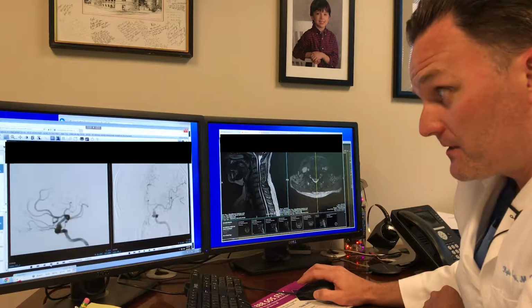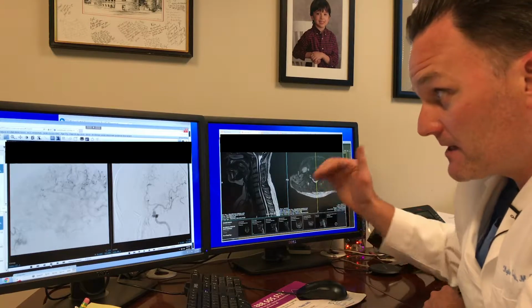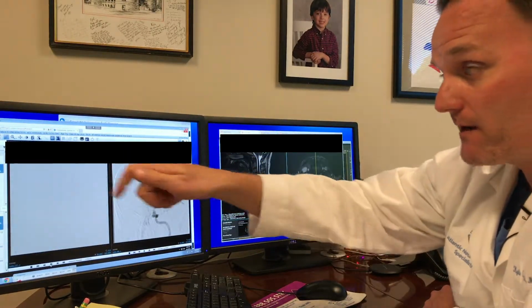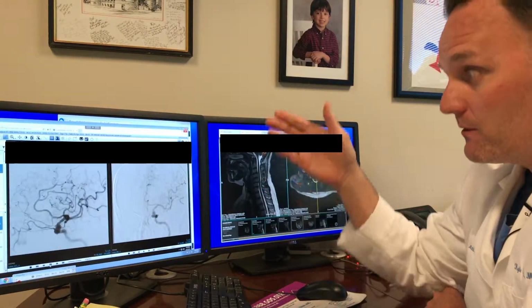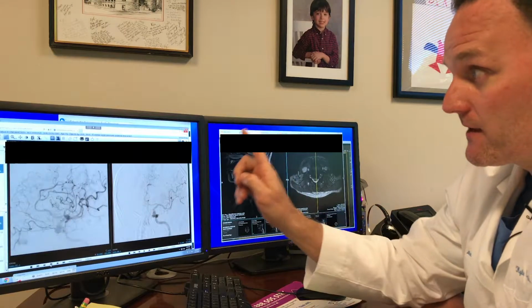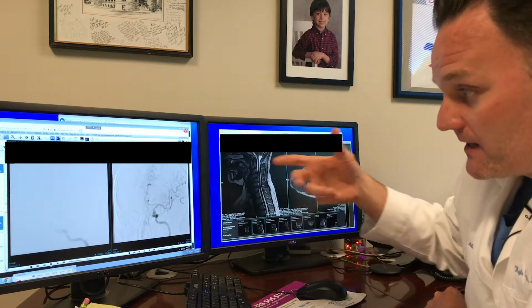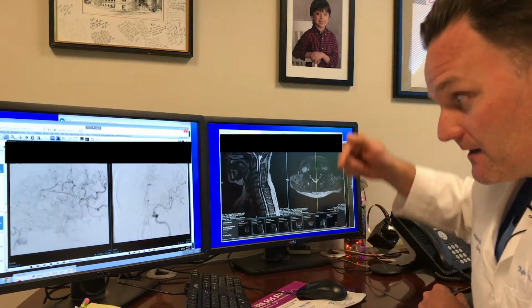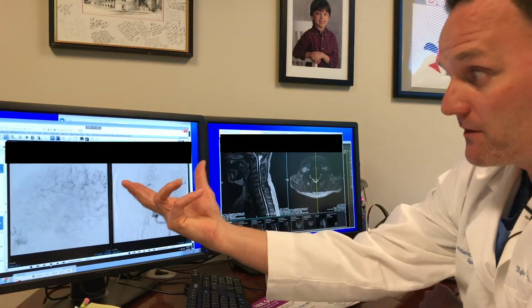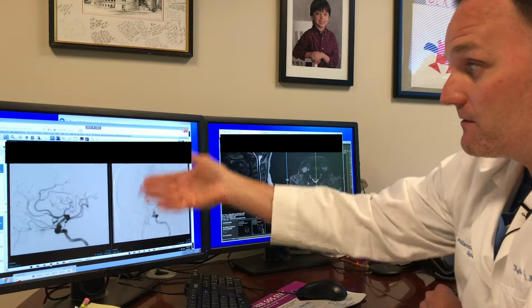That's the approach. And then the catheter is a very small tube, specially designed to go through the blood vessels. We guide the catheter, the tube, over a small wire to direct it where we want it to go. We pick the blood vessel we want, and we take the wire out. The catheter sits inside the blood vessel, and then we inject the dye into the tube of the catheter, and it flows out and is distributed into the blood flow where the catheter tip is, and then it flows up to where we want.